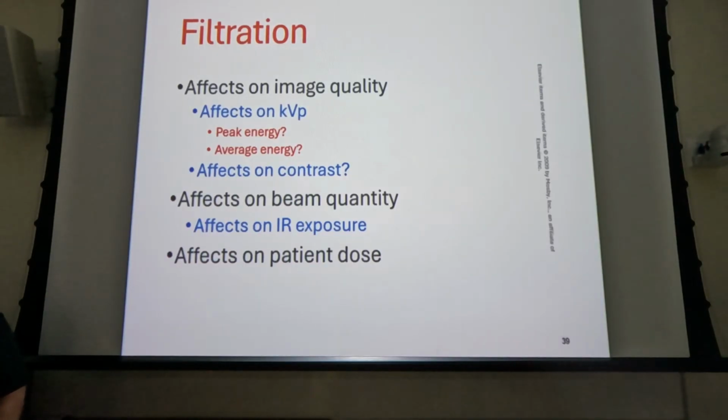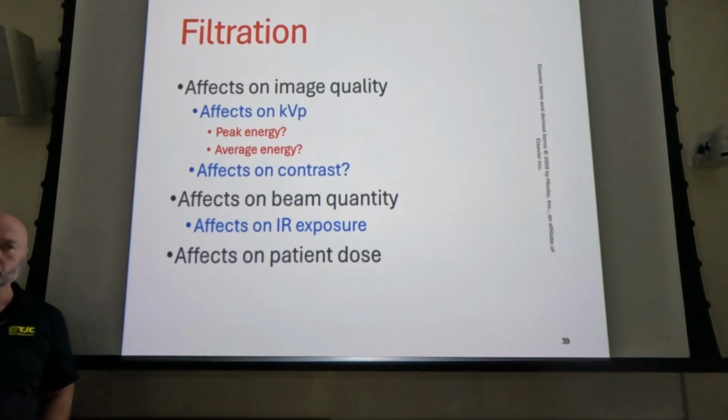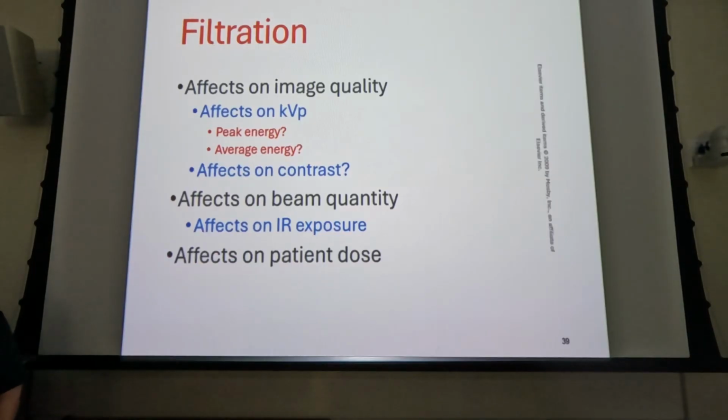Increase, specifically, almost universally, unless the question is asking you for more penetration. To repeat but not double the patient mass, what are you going to increase? mAs. You lost quantity, you need to reintroduce quantity. So you increase your mAs, right?